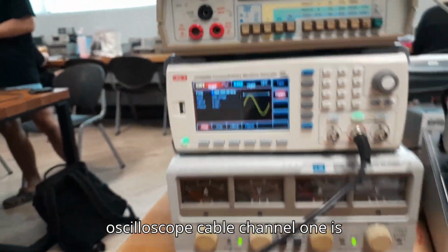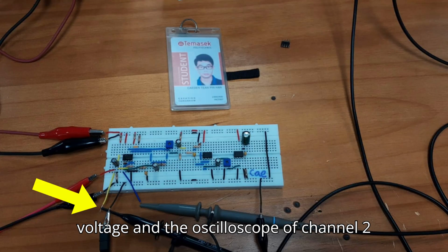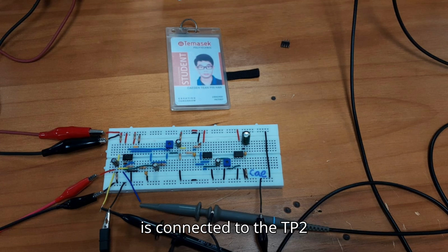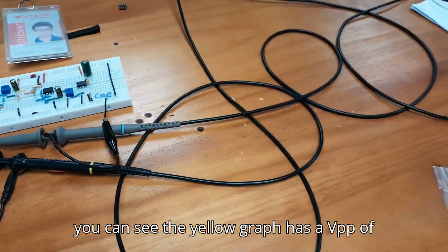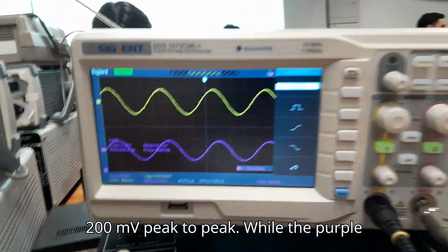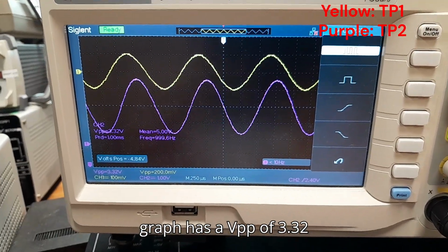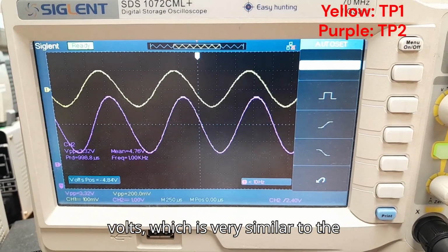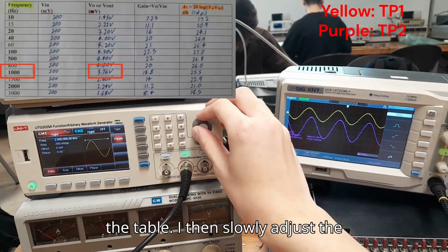The oscilloscope cable channel 1 is connected to TP1, measuring the input voltage, and channel 2 is connected to TP2, which is showing the output voltage. As you can see, the yellow graph has a VPP of 200 mV peak-to-peak, while the purple graph has a VPP of 3.32 volts, which is very similar to the voltage shown under the Vout column in the table.